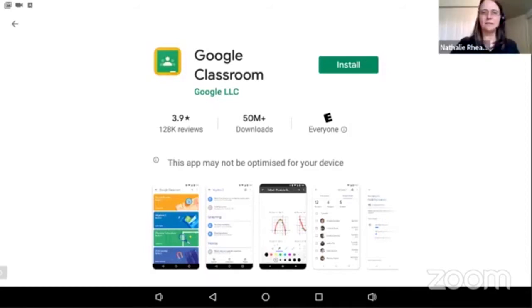Okay, I can take the next two questions on the chat. So, is this update available for the first generation of Prodigy? And will these features be available as an update for the Prodigy I have right now? So, yes, these updates are available for all versions of Prodigy, for all versions of tablet. We've worked on it and it is stable. Tomorrow, when you open or turn on your tablet, you will have a notice telling you that there is an update available, and then you will press on it just to download.